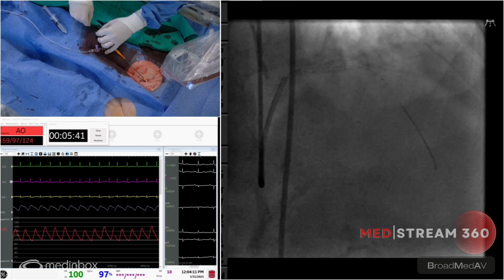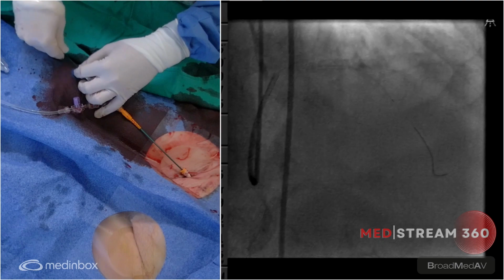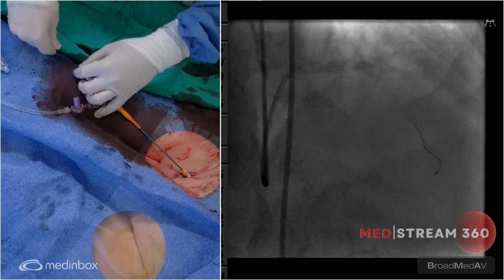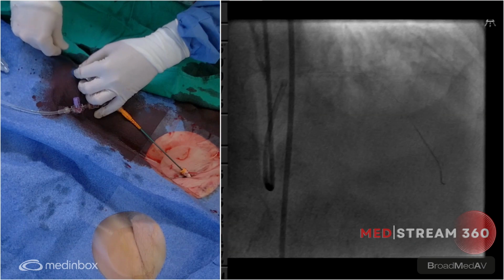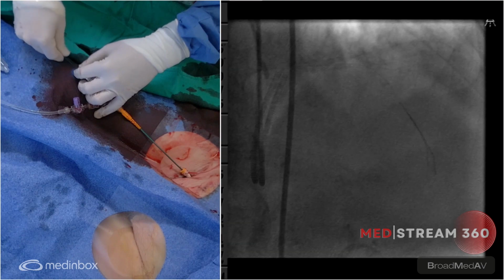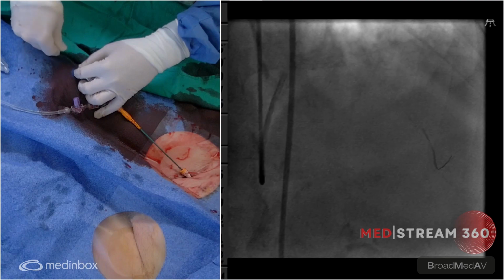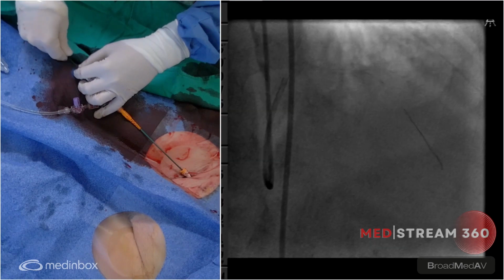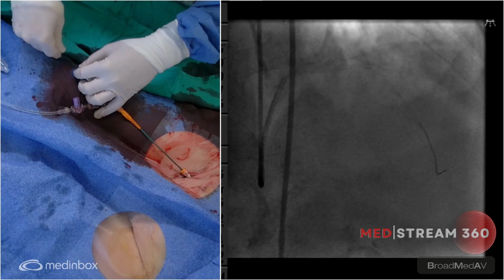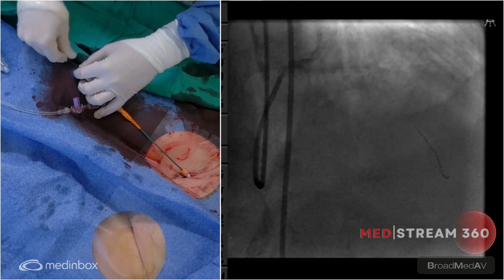I could just tell this wire doesn't want to move too much. I think the lesion is sort of hugging it. Couple tortuosity. I'd like to get it as deep as possible. See if I can get it in there. We'll get the OCT ready. Or let's get some contrast. A little puff there. Just give me a little puff. I just want to see whether I am in.